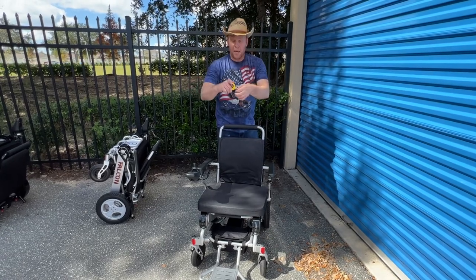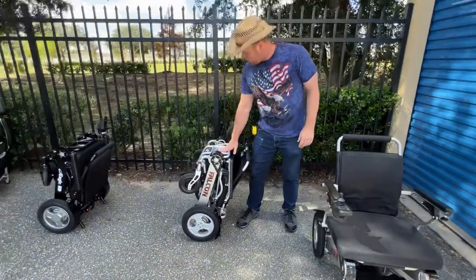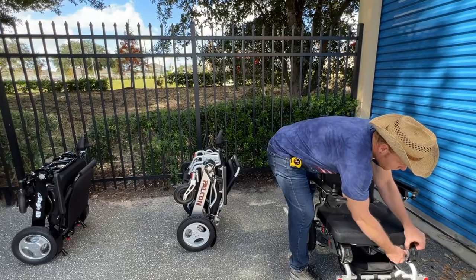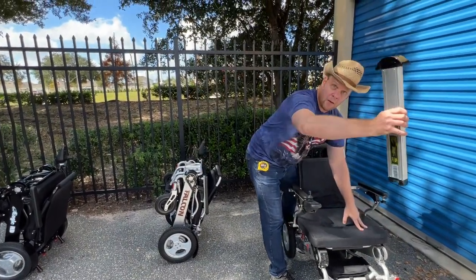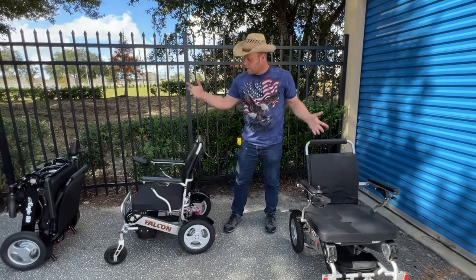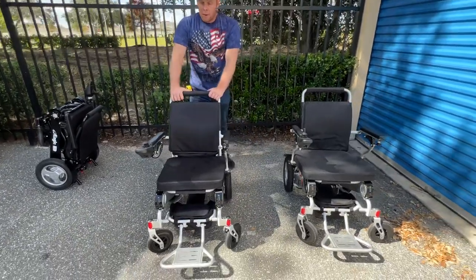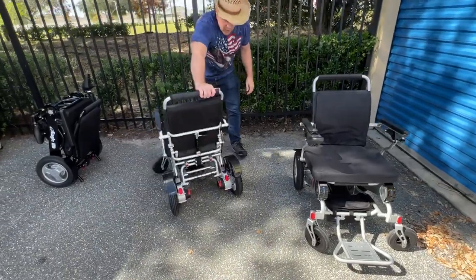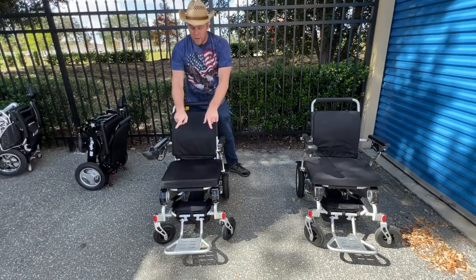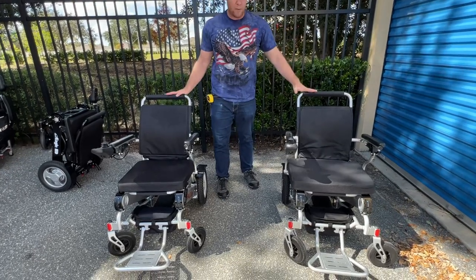Let's take a look at the Falcon next. You can see that it looks very similar from the side to the Electra 7. Both the Falcon and the Electra 7 have the in-frame battery design. In fact, all of the chairs here except one have the in-frame battery design. Same way of unfolding. This is also an FDA registered and FAA airline approved chair. This chair has the ability to go into freewheel, and for all intents and purposes, this chair is almost exactly the same as the Electra 7. There are a couple of small differences I'll point out in just a moment.